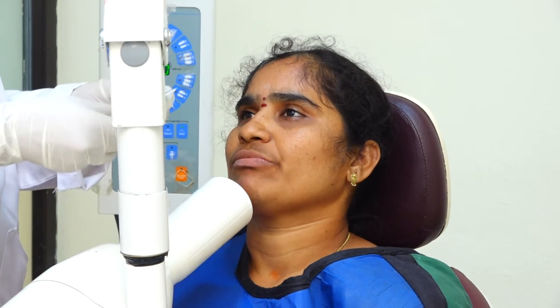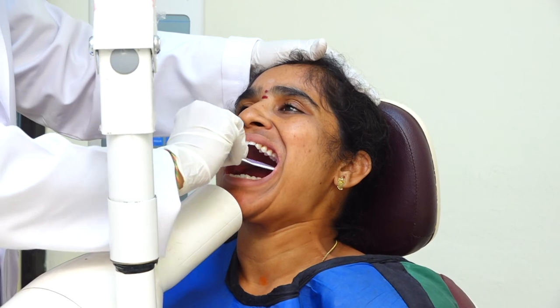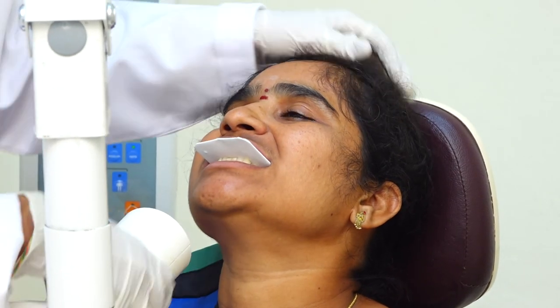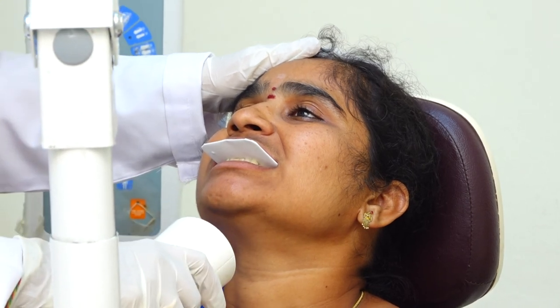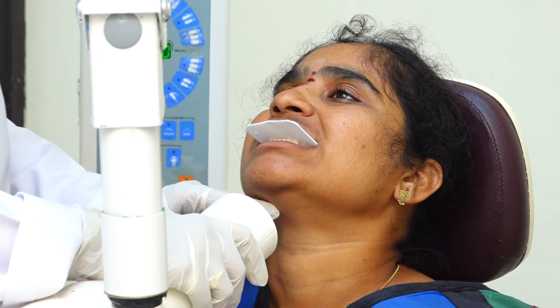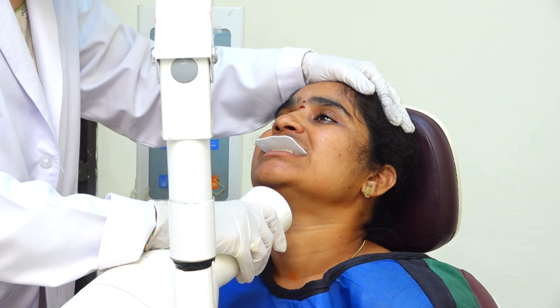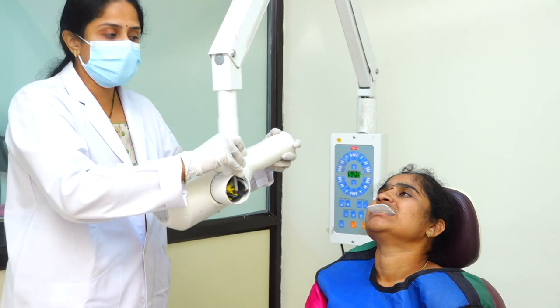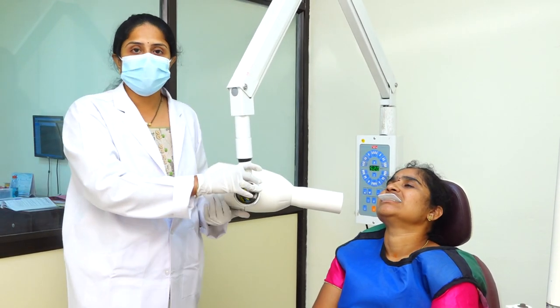Let's have a demo on the lateral mandibular radiograph. I am placing the lateral mandibular film on the left side. Ask the patient to bite on the film and the patient's head should be in the semi-reclined position. The exposure should be 3 centimeters below the chin and 3 centimeters towards the side of interest. Adjust the X-ray tube accordingly and expose the film. These are the various types of occlusal radiographs taken depending upon the case situation. Thank you.